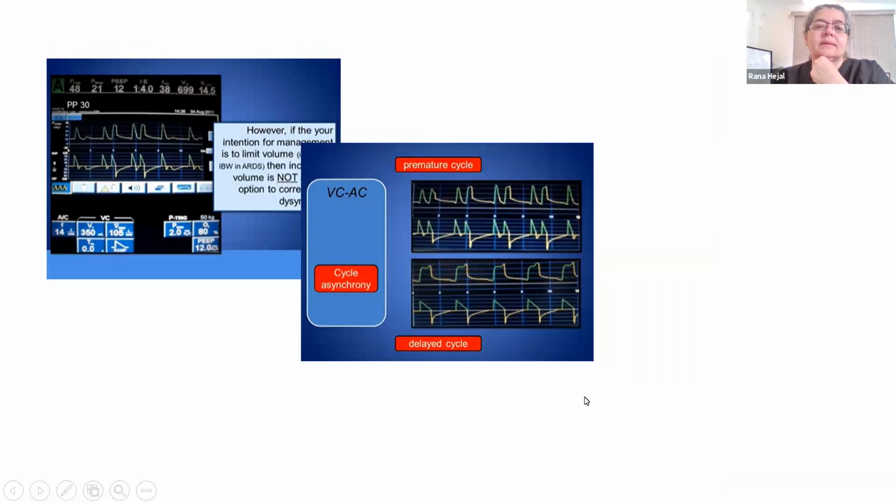All right. So this is the cycle. Now, this is the premature cycle. This is when they need an inspiratory time a little bit longer, at least in part of it. There is also the opposite, like they have too much time to exhale, and that's what you see over here. This graph is not the best, but you see the exhalation part has occurred, and then you have a flat line for a while before the next breath is happening.